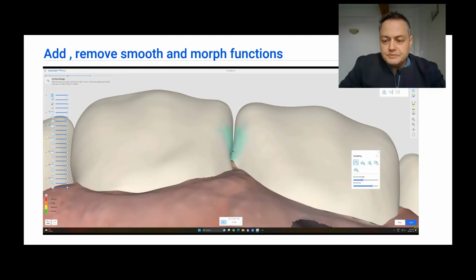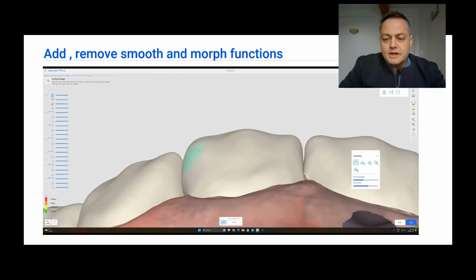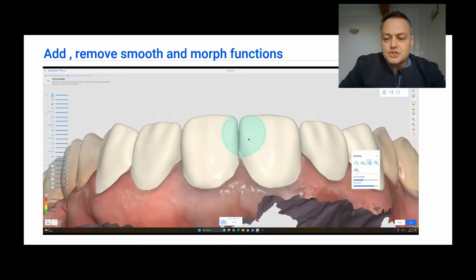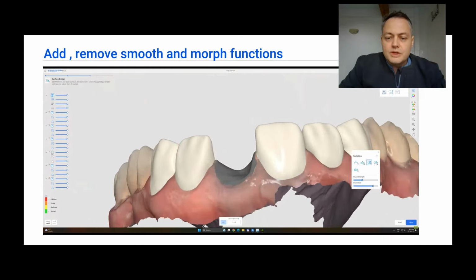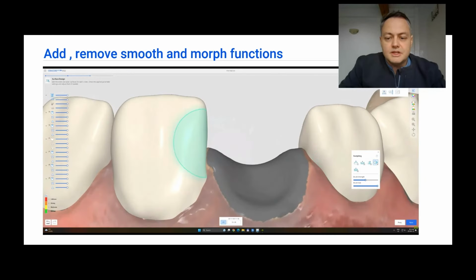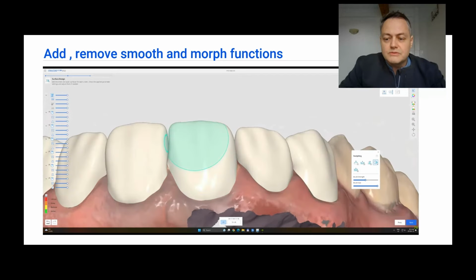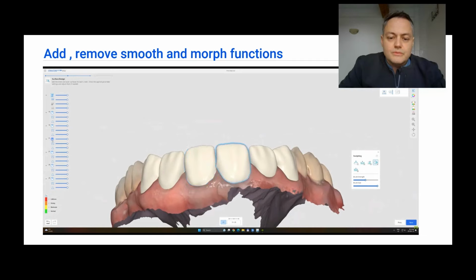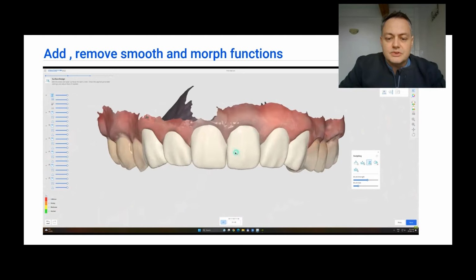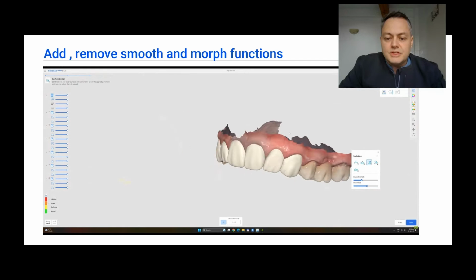of these shapes. As you can see, we have five tools at our disposal. The number one adds material, the second subtracts material, the third smooths the shapes out, fourth is going to let you pull on margins in any direction you need to, and the last one has just recently been introduced, the fifth one, that actually allows to design very, very small details on the surface and actually subtract it. You are going to be able to cut with it very small details.